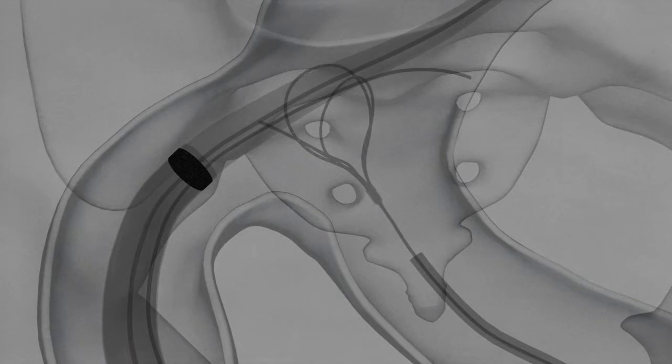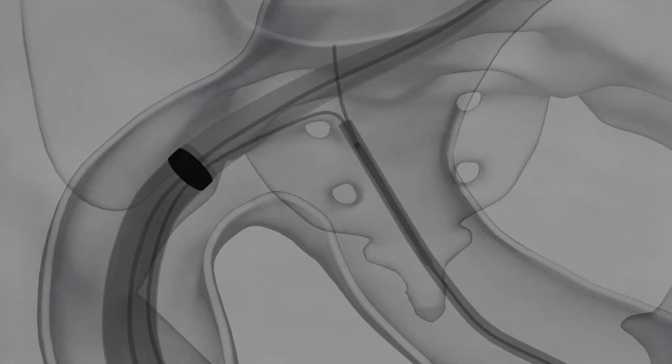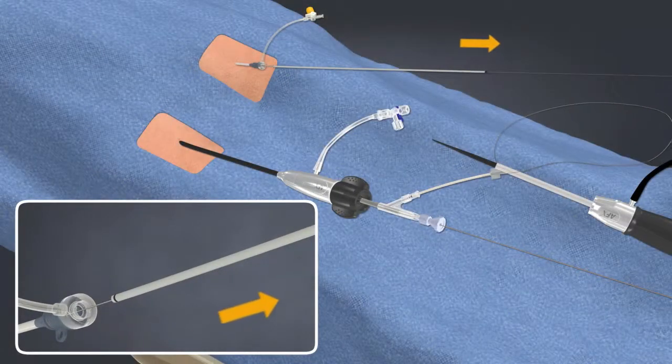From the contralateral side, using standard snaring technique, snare the floppy tip of the contralateral limb wire and bring the wire out through the 9-French sheath.